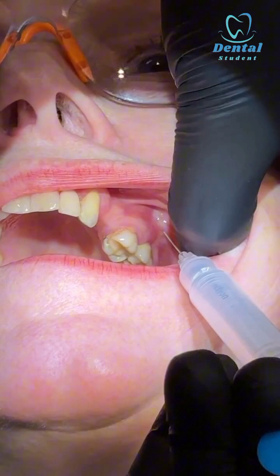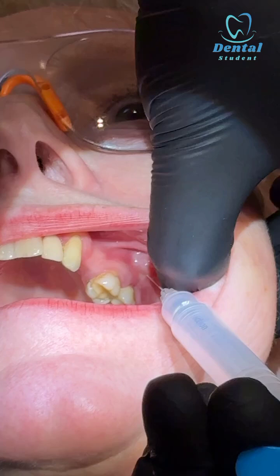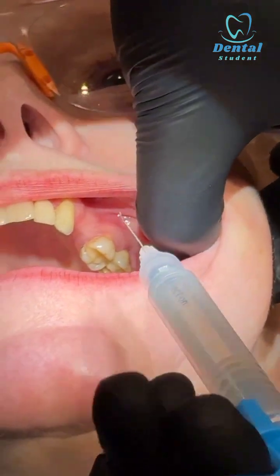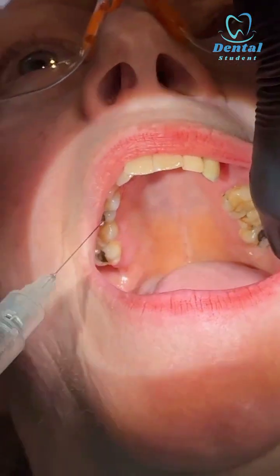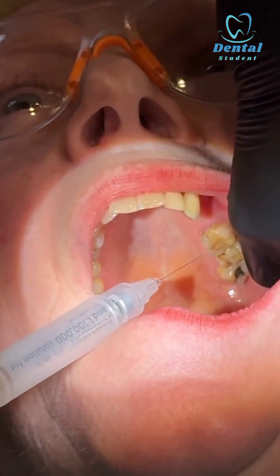As you can see here, this is for the posterior superior alveolar nerve — so that's the first one. Then the other one is for the greater palatine nerve, so I go open and go at right angle to the gum like so, toward the apex of the tooth — sharp scratch, as you can see here.